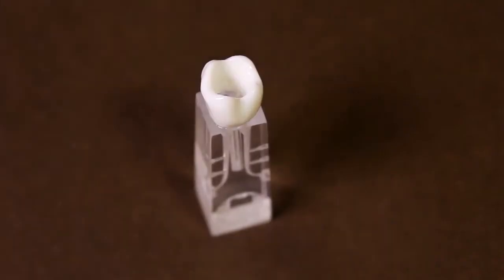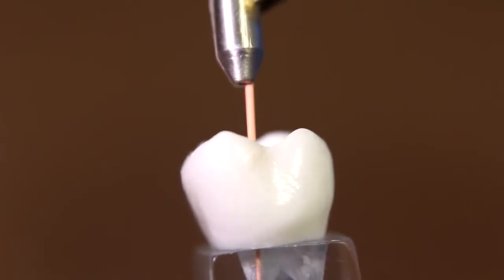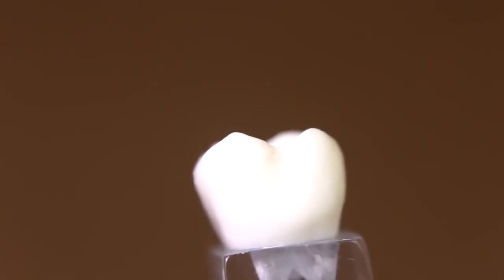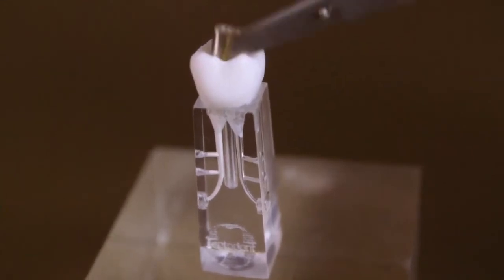To place Bioroot into the root canal, perform the root canal cleaning and shaping procedure using standard endodontic procedures. Select the corresponding gutta percha master cone and check that it fits snugly and to working length. Remove excess fluid from the root canal with paper points.